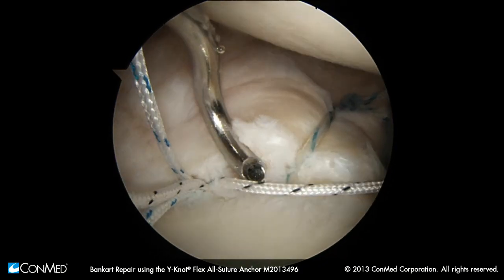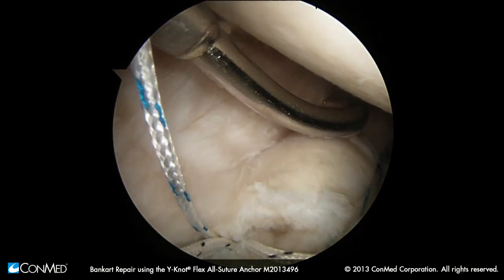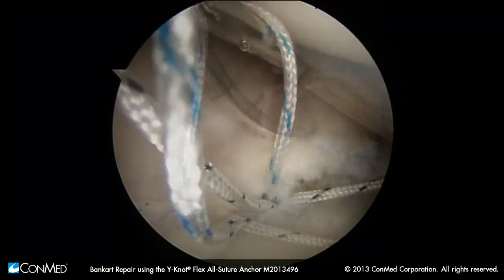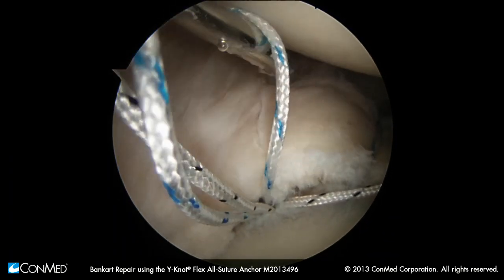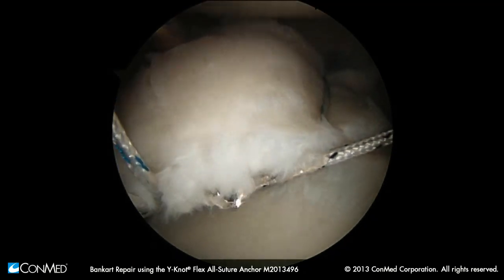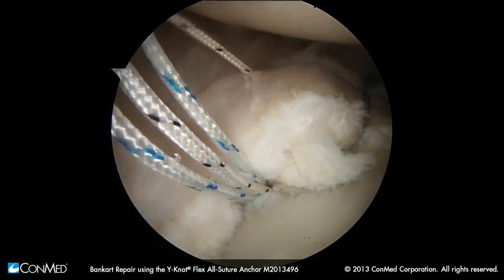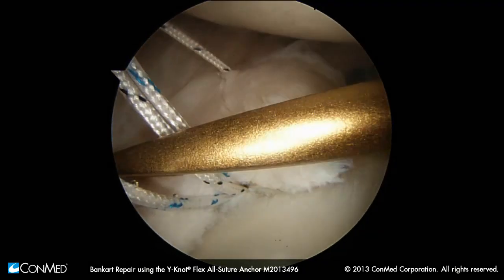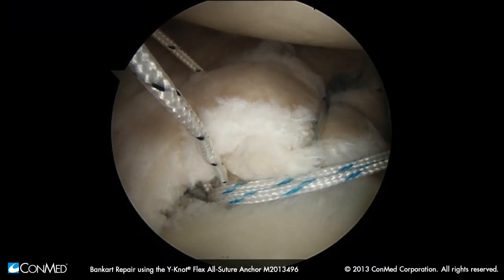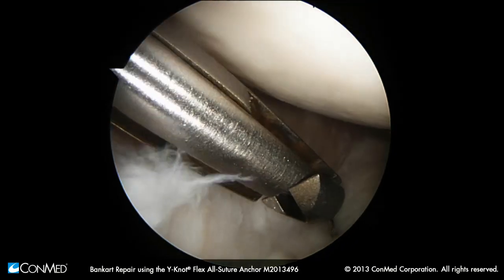Just like we did last time, we'll rehearse and say: I want to end up here. I'm going to come down inferior — we don't want to be above, we want to be advancing this capsule as far up as we can. It's a nice fine motor motion that enables us to keep control while still exerting good pressure. Then I'll work my stitcher through right where I came from, come through again, and feed our shuttle. Now I'm going to tie — I'll get these other sutures out of the way. We'll pluck these blue ones out the back so that my anterior mid-glenoid portal only has one stitch in it. I'll establish my post — I know which one it is because it just came out. And we're done with that pass.